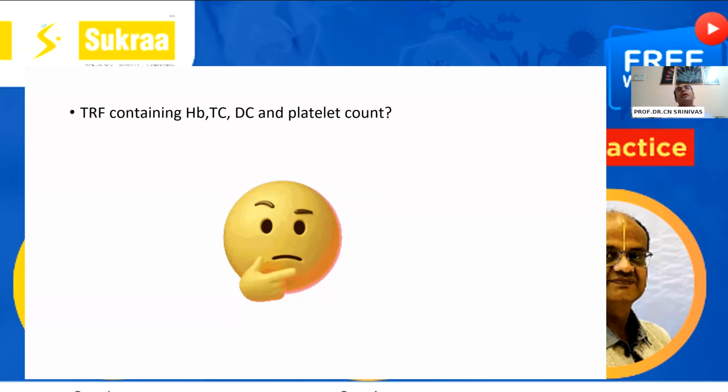A DC, in a small setup especially, may involve a 3-part DC. Again, a technician has to sit and do a DC. So we just say, go for a platelet count and just monitor that, going by the best practice guidelines. So probably that is the reason the TRF has these options of hemoglobin, TC, DC, platelet count, apart from the CBC. And apart from the hemogram, hemogram includes the complete blood count with the ESR. So these are the different facets, and some CBCs may include absolute counts as well, right? So these are my thoughts on it, but of course, sir can add much insight into it.